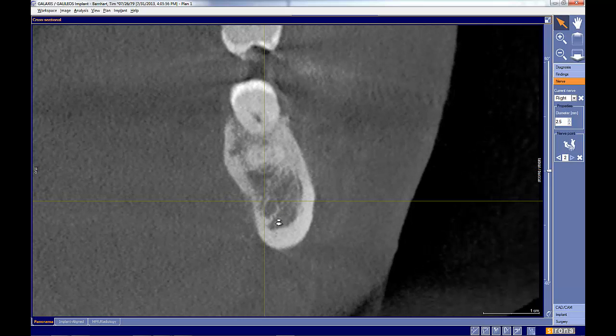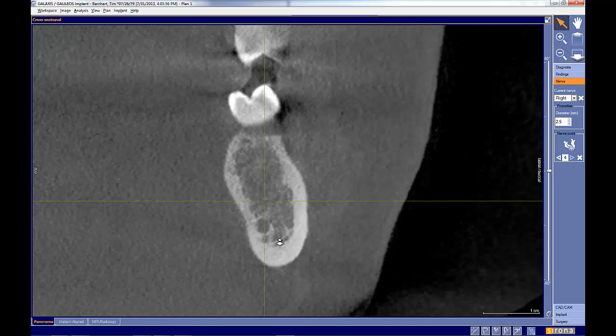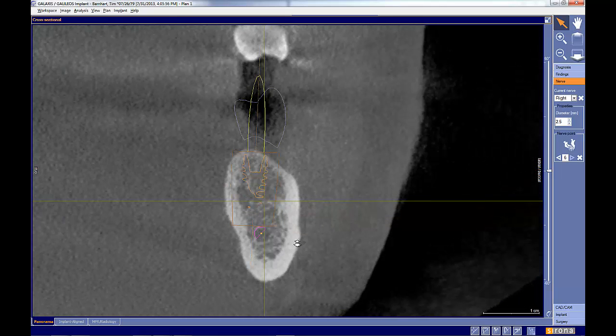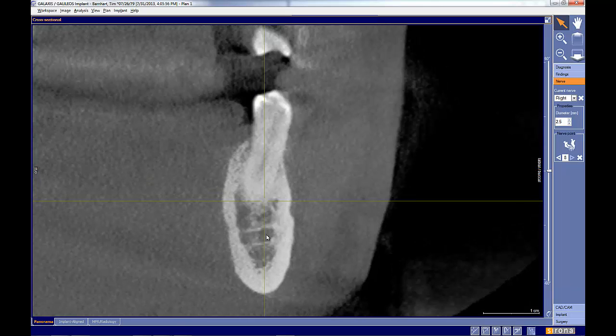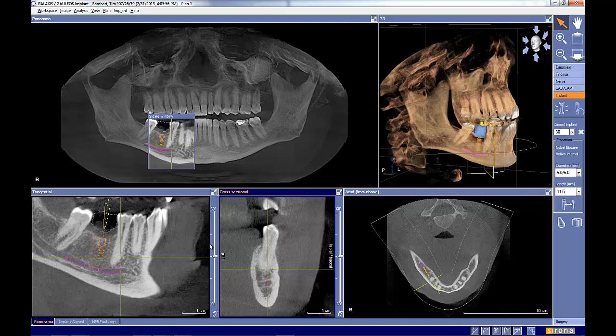We're going to continue to move forward, double click, move forward, double click, move forward, double click, move forward, keeping an eye on the canal right there, double click, move forward, double click, move forward, double click. And for me, that's pretty much all I would do for this nerve mapping. Now we have a good nerve mapping in this particular case.